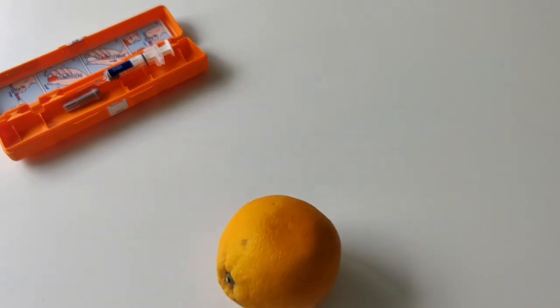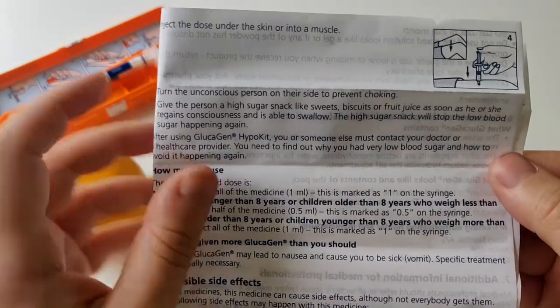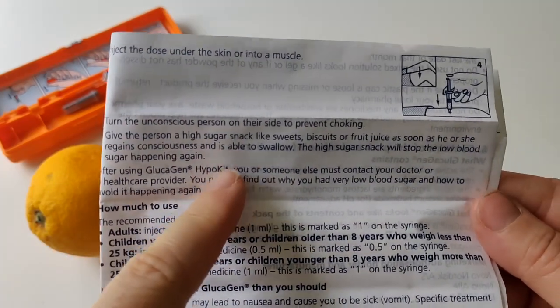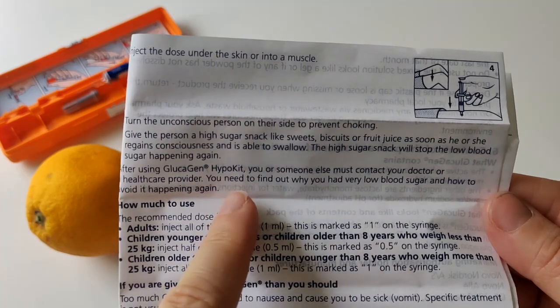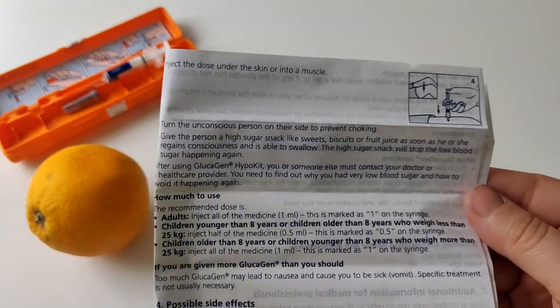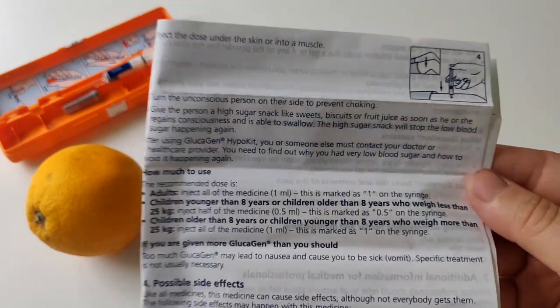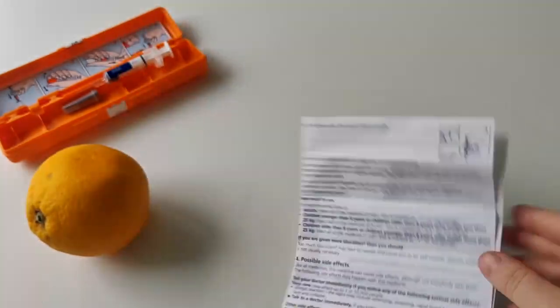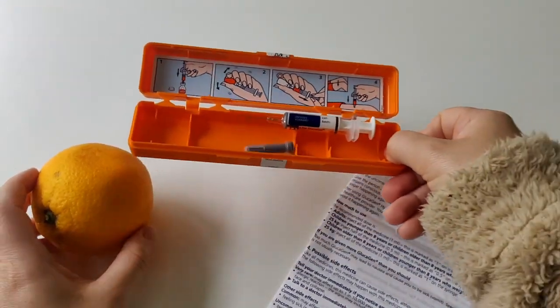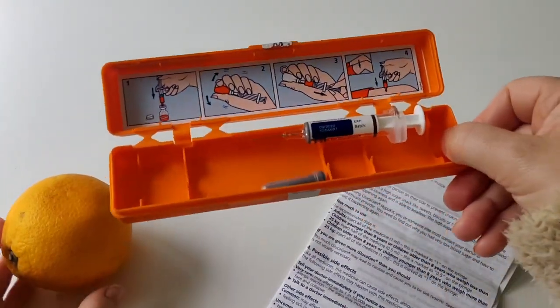After injecting, put the person in the recovery position. When they wake up, give them high-sugar sweets to keep their blood sugar up, followed by a high-sugar snack. If this happened and you used the kit without a paramedic, contact your GP or diabetic nurse to inform them. That is how to use the glucagon hypokit.